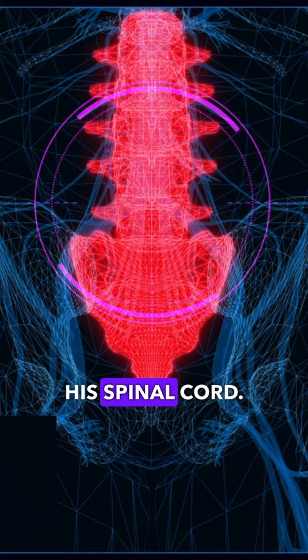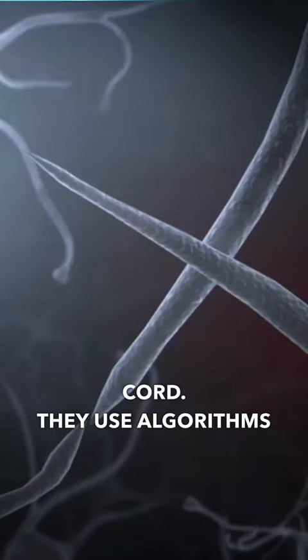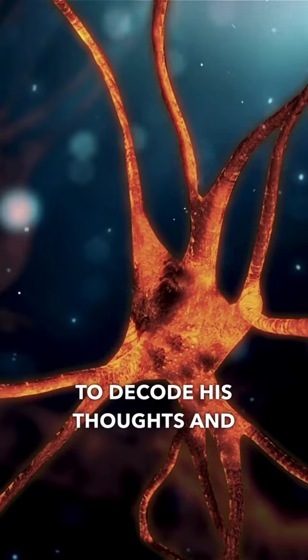AI-powered implants are like a digital bridge that connects his brain and spinal cord. They use algorithms to decode his thoughts and send signals to his lower spine to move his legs.